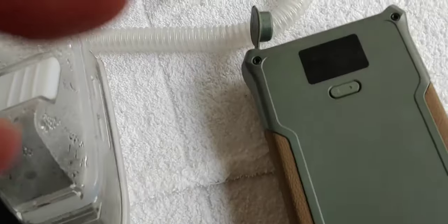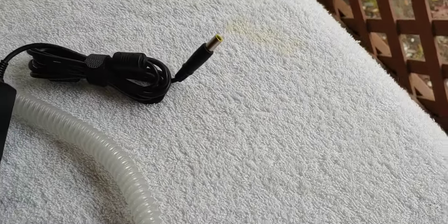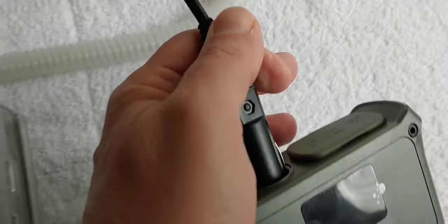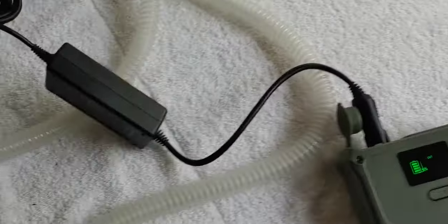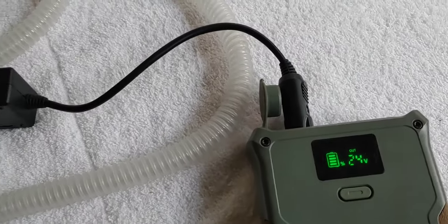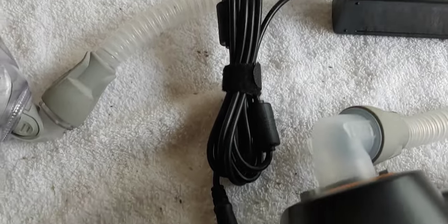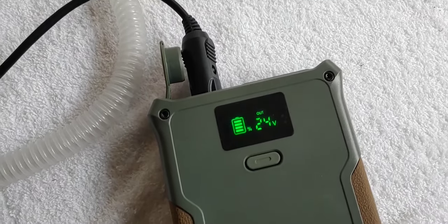I also wanted to show you how easy it is to use the cigarette adapter with this EasyLonger. You simply take your cigarette lighter adapter, plug it into the cigarette adapter right there, bring this over, and plug it into your CPAP machine. It comes on nice and easy. And that's just how easy it is to hook that up if you're camping in a car, in an RV, somewhere where you only have your cigarette lighter adapter.